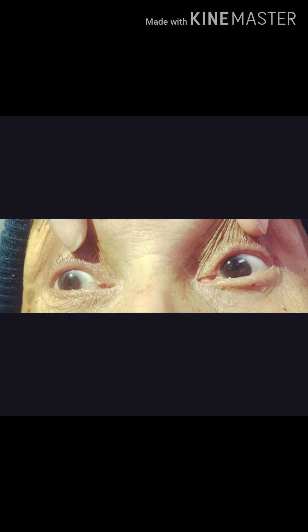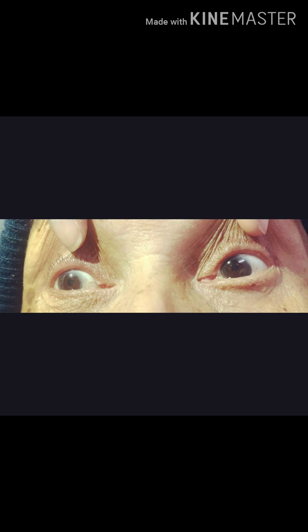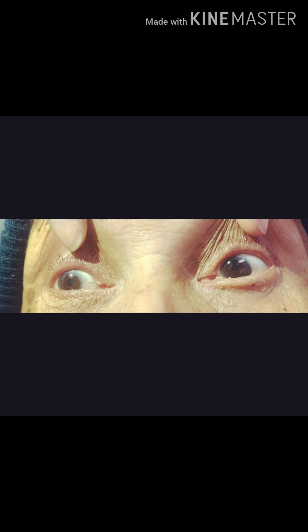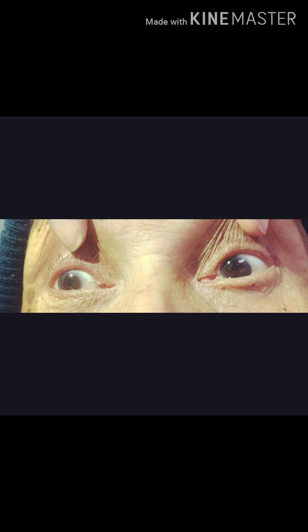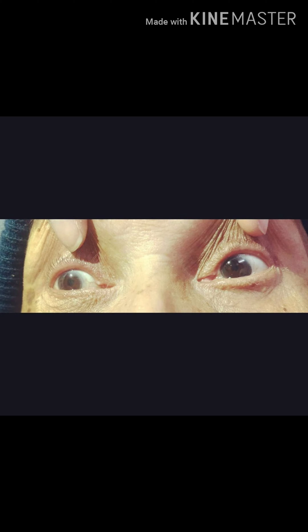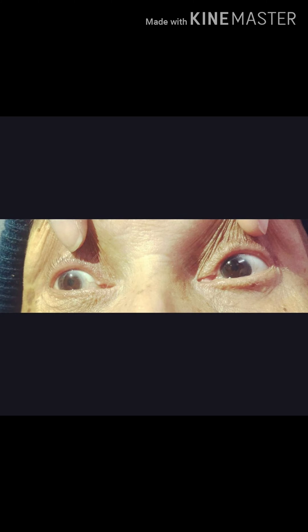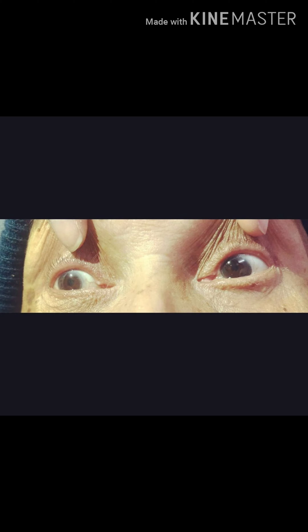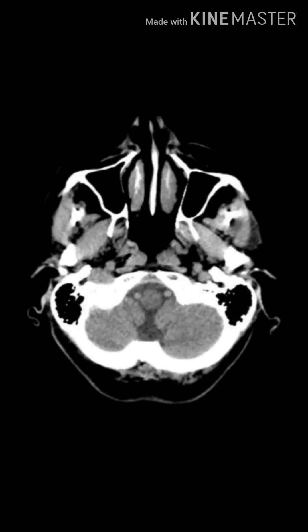Greetings viewers and doctors. I'm Dr. Isha Khan from Medical Tube. Today with a new case: an 84-year-old woman with no comorbidities, presented with weakness in her left body and a right dropped eyelid. On neurological examination there is left hemiparesis grade 4, dysarthric speech, and right complete ptosis. This is the first scan of the patient.